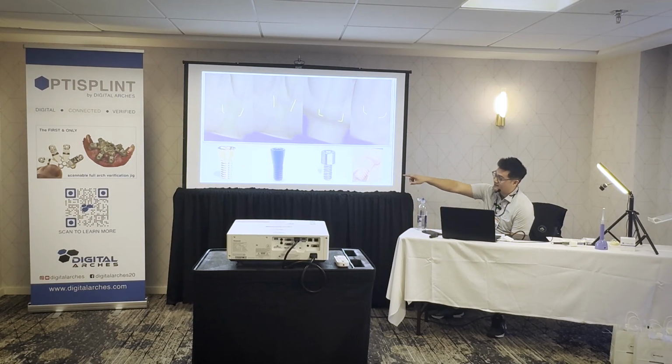So there's a Vortex. That's the Desk screw now, which is that blue violet. This is the Desk and the silver, and this is the Powerball. And the problem, and I've been saying this for the last 3 years, is that except for Desk, none of these screws are made by real companies. They're made by dudes or labs. So if something happens, like if they get failures, if the FDA steps in, what's going to happen to these screws?